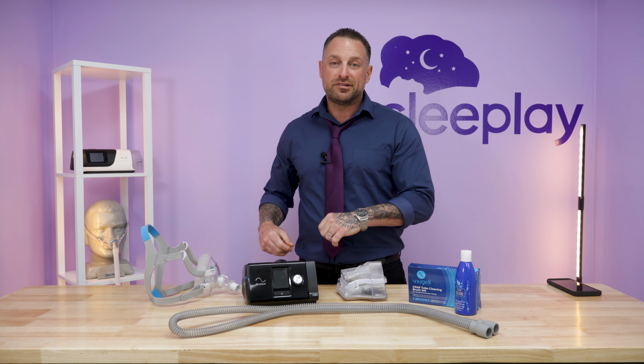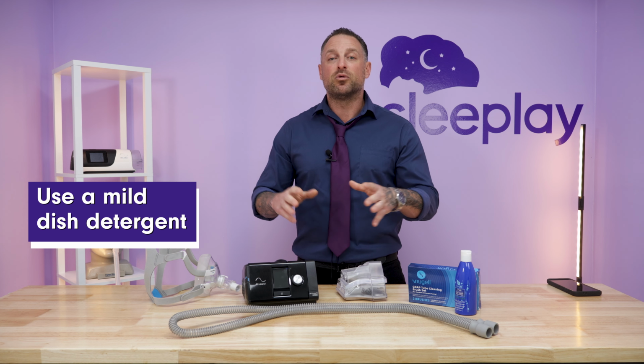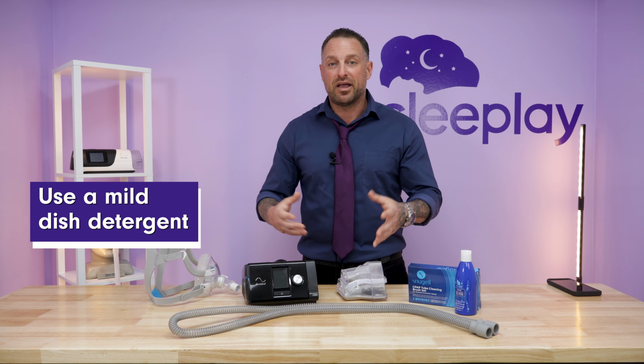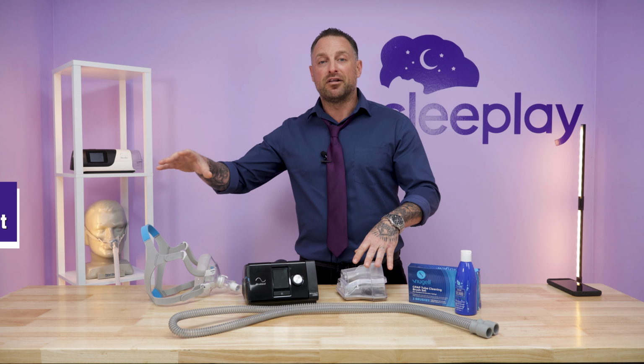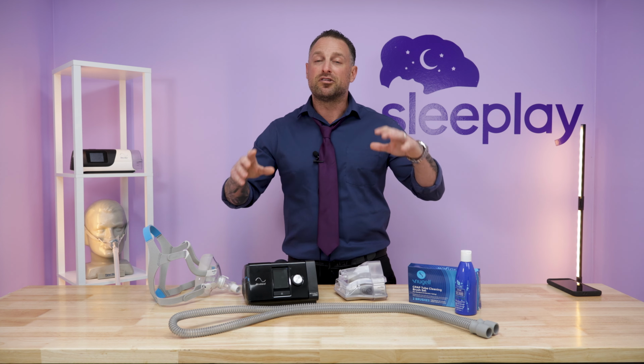If not, you might have to do this separately, but you're going to go ahead and use that drinking water or filter water, whatever you have, and wash these things out with warm, mild dish detergent, okay? You're going to clean these out. You're going to scrub the headgear thoroughly, and the water chamber.